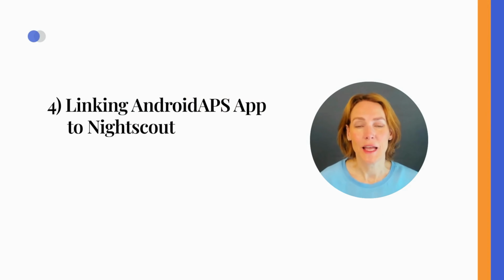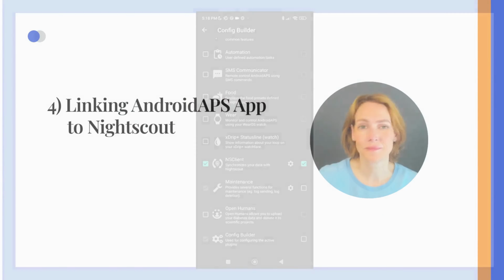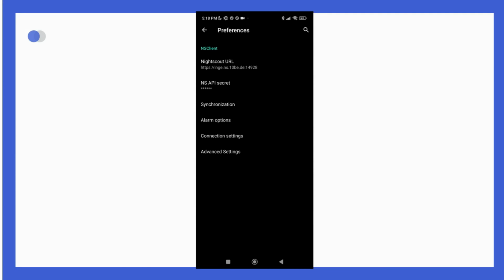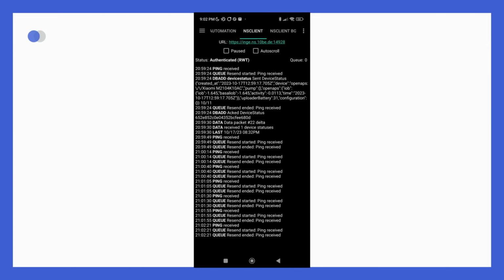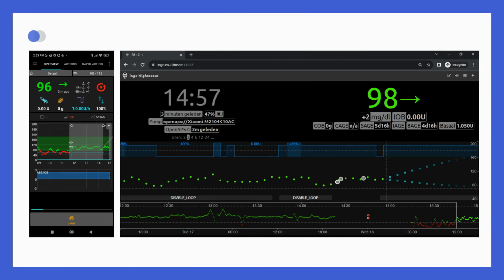4. Linking the AndroidAPS app to Nightscout. When setting up the AndroidAPS app, you will be prompted to enter your Nightscout URL and password. If you haven't done so during the initial setup, you can also enter this information later via the configurator. Once you have entered your Nightscout credentials, you can navigate to the Nightscout tab within the AndroidAPS app. In this tab, you can see how data is being forwarded to your Nightscout website. Linking AndroidAPS to Nightscout allows you to seamlessly transmit your diabetes data to your Nightscout website, where it can be accessed and monitored in real time. This provides you, your loved ones, and your healthcare provider with valuable insights into your diabetes management.